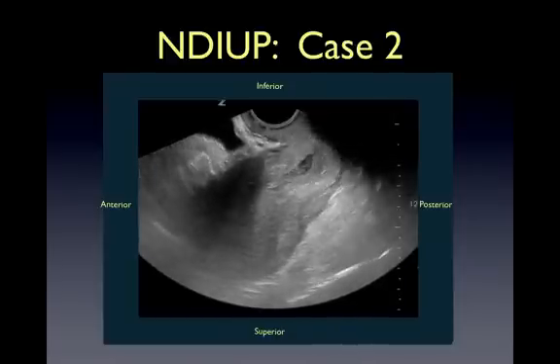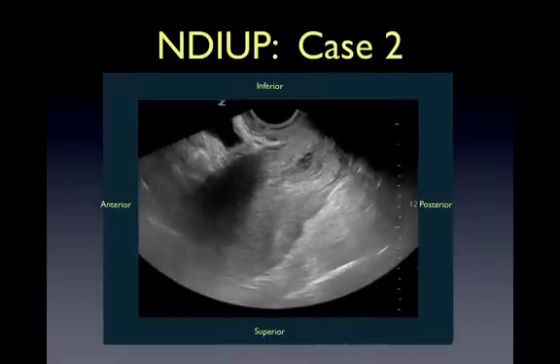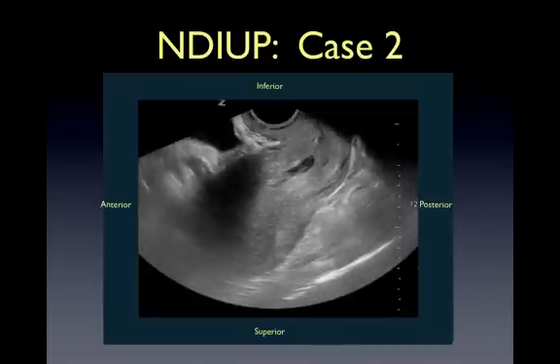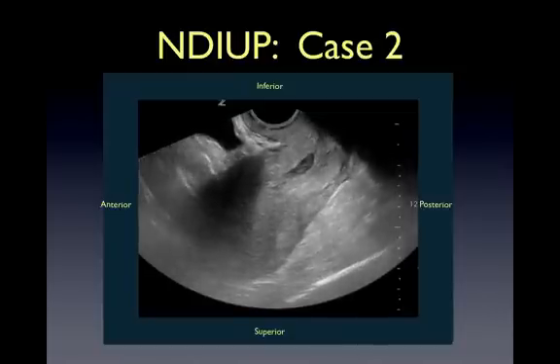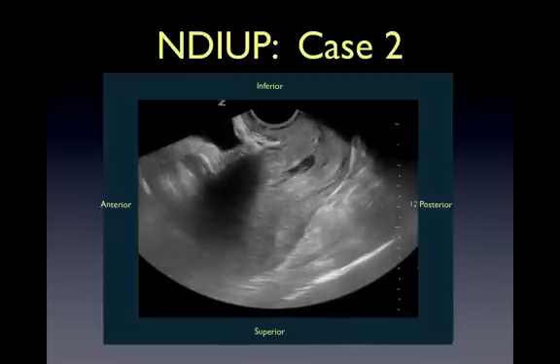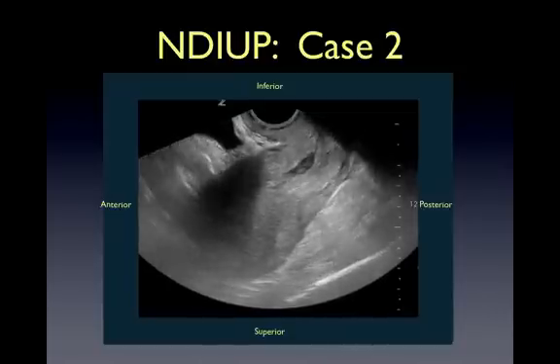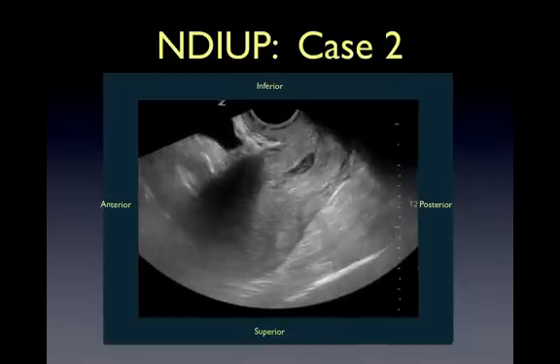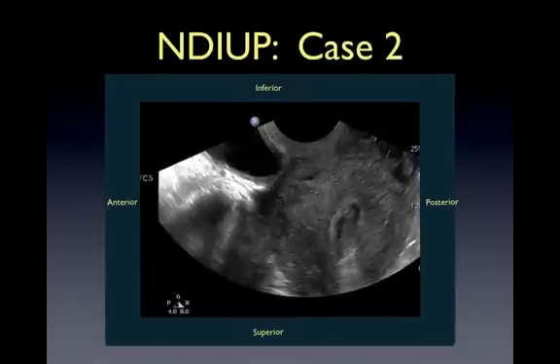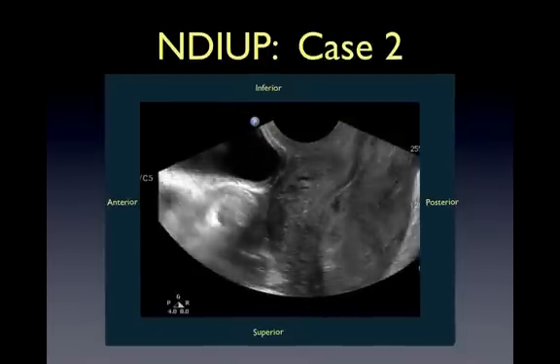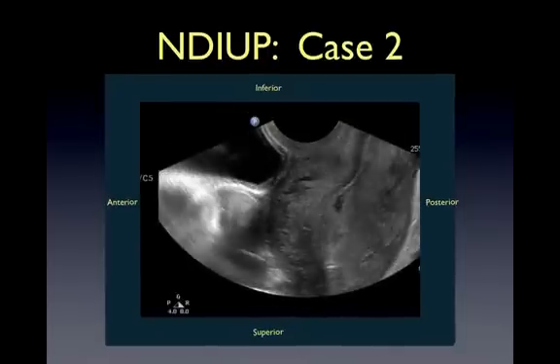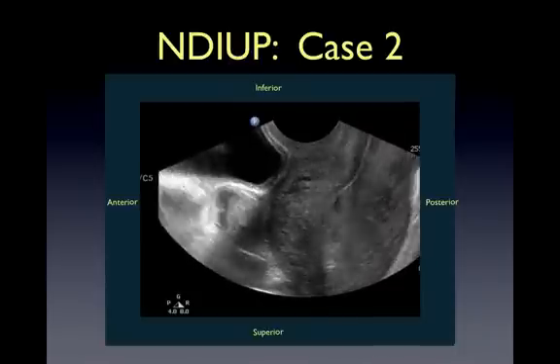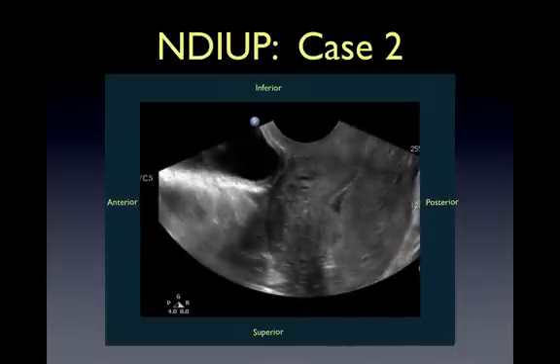Here's a second example of an NDIUP. We are looking at a sagittal view of the uterus, with the bladder seen anteriorly and inferiorly, and within the uterus there is a hypoechoic area that lacks a surrounding double decidual sign or yolk sac. On closer inspection, it still lacks a double decidual sign or yolk sac, and likely represents a clot or polyp in the endometrium.